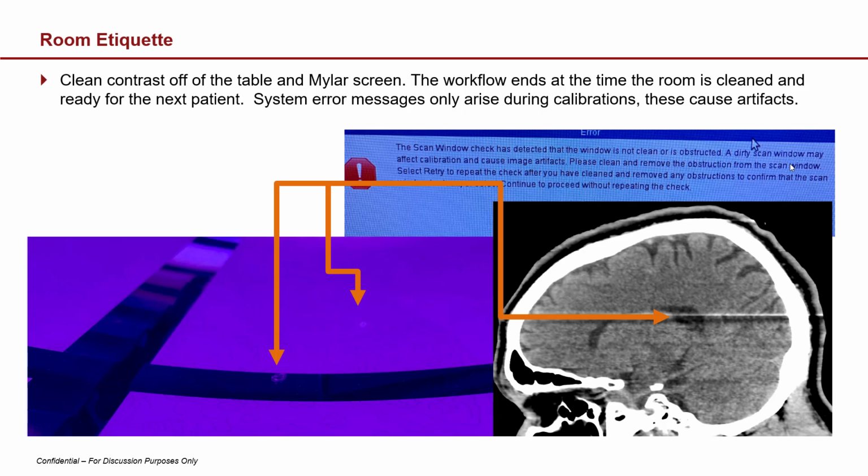Now, most scanners will actually ask you to do a Mylar check during the morning calibrations. So this generally won't happen for longer than a day. However, you want to keep in mind that if it's on the table, you're not going to get a warning from the system saying you're going to have artifacts because your Mylar screen is dirty. So best practice, just always keep everything clean.